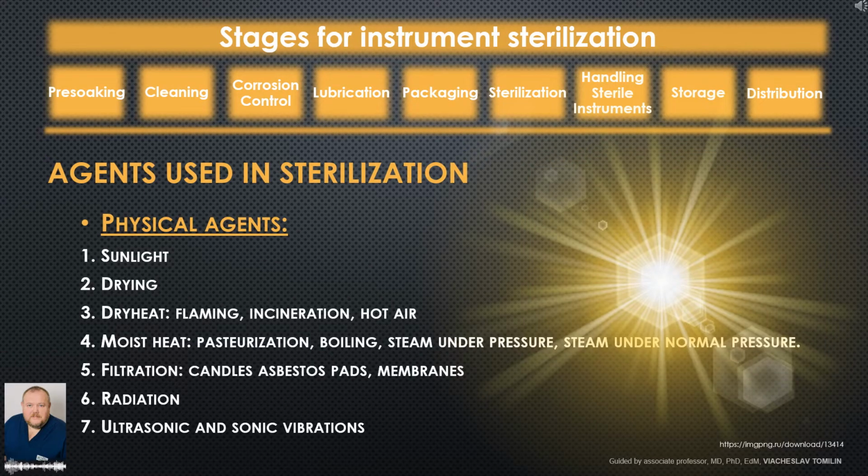Sterilization. There are many stages for instrument sterilization. They are pre-soaking, cleaning, corrosion control and lubrication, packaging, sterilization, handling sterile instruments, storage, distribution.